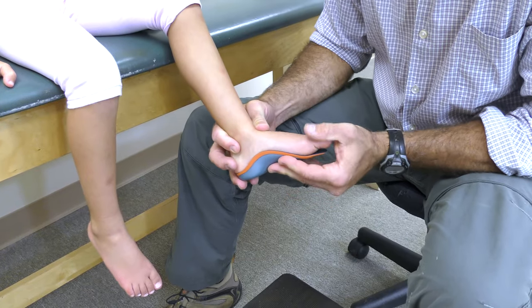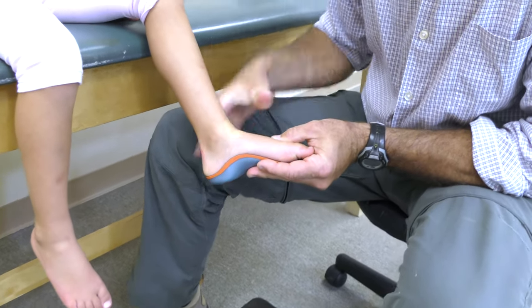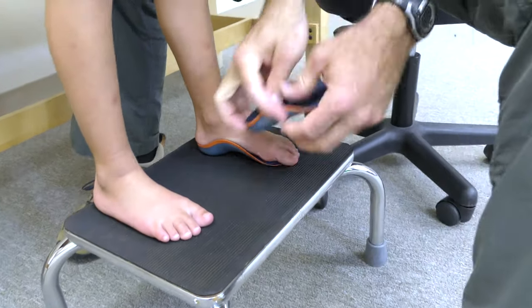Find the correct size orthotic. Make sure the highest part of the support is placed in the center of the arch while the back cups the heel. A great way to evaluate the fit is to stand in the orthotics with them outside the shoes.